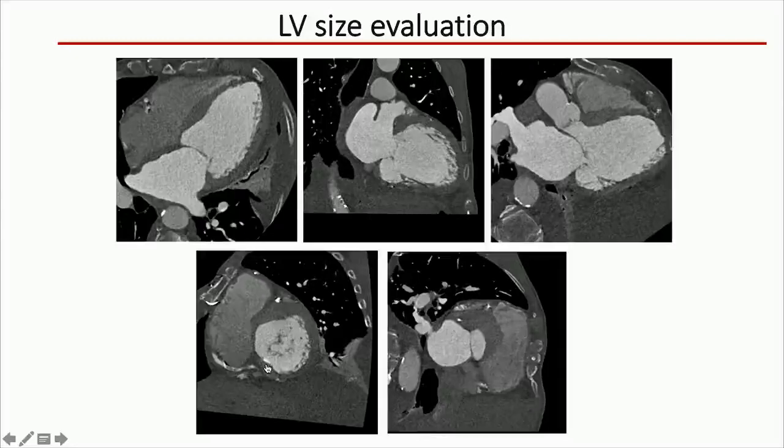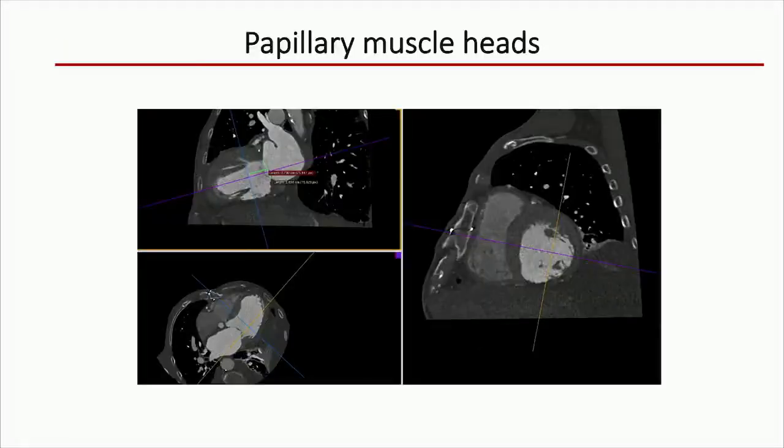Once again, you can see some calcification at the annulus and also some thinning over the septum. On the right-hand side, you can actually see the left ventricular outflow tract area, which will be a point of consideration, which we'll review on the subsequent slides.